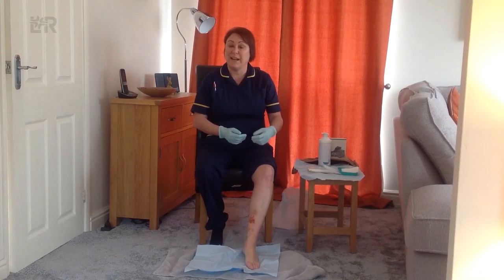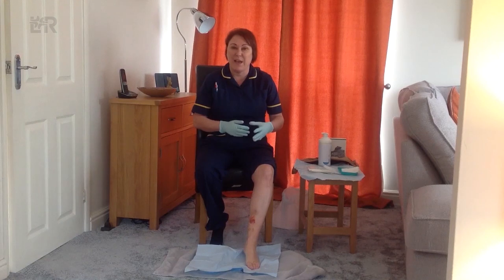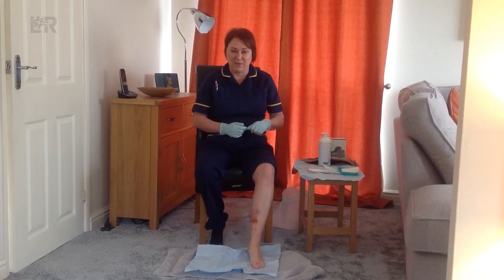Our leg is washed, our wound is cleansed and we've tackled some of the surrounding hyperkeratosis to our skin. So now we're ready and prepared to reapply a fresh dressing and then our compression hosiery.